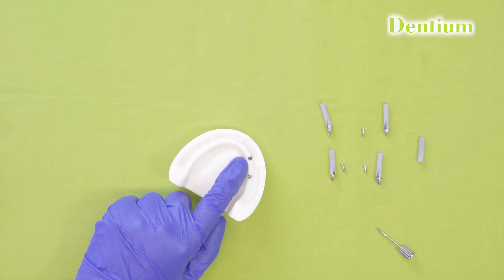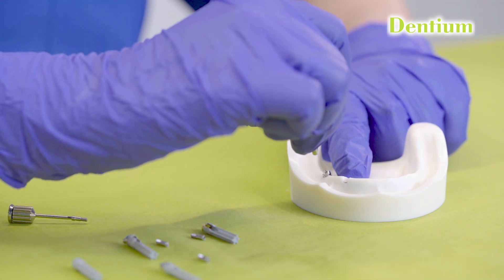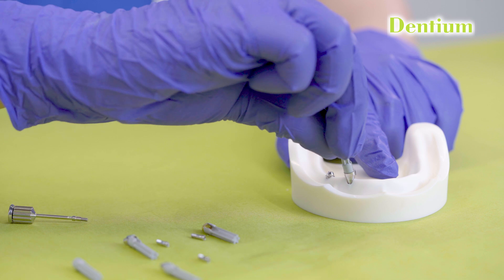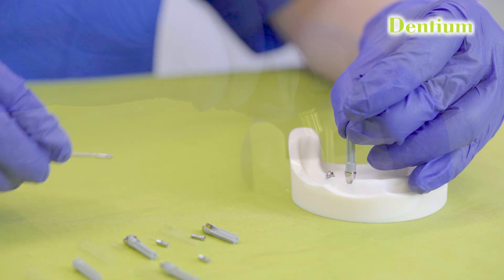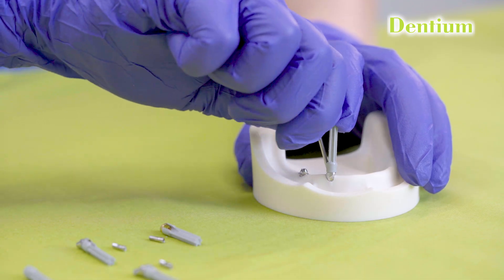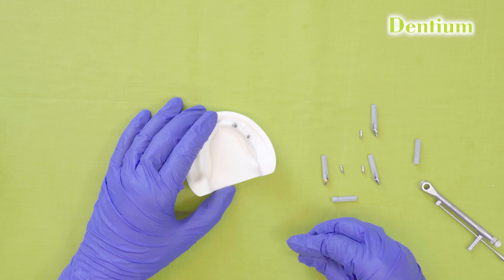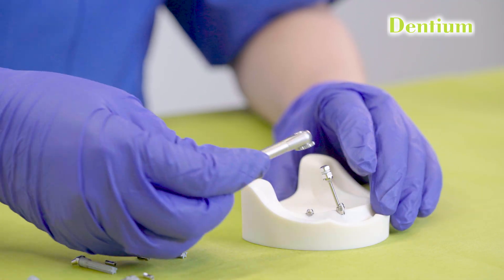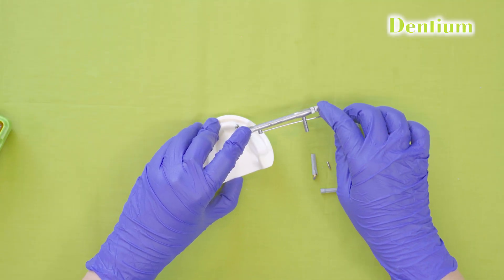For placement of a multi-unit abutment over the angulated implant, we just have to pick an angulated multi-unit abutment with the delivery holder. We will stabilize it and position it over the implant, then put the screw over the multi-unit abutment and tighten the screw completely. After placement of the angled multi-unit abutment with the help of the handheld hex driver, we will fully tighten it with the torque ratchet driven prosthetic driver, giving a torque of maximum 25 to 30 Ncm.